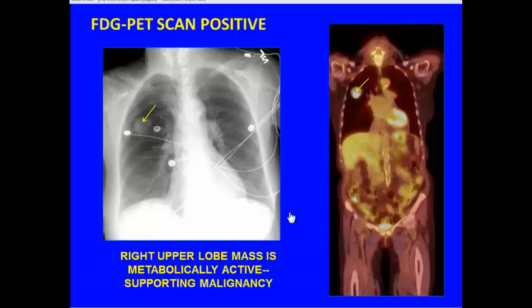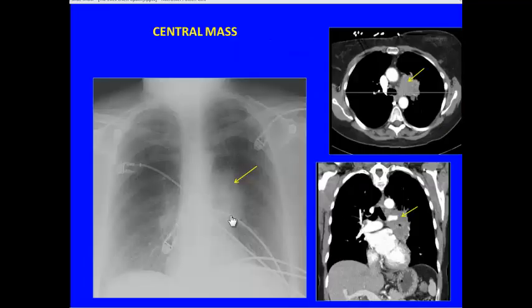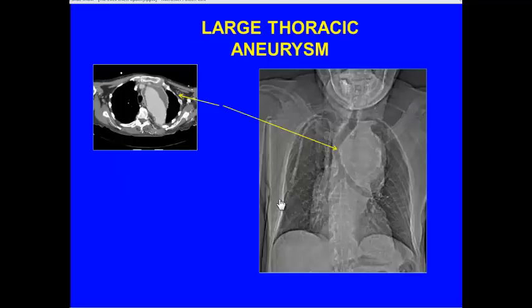So what else would we look for? Well, with our imaging now, with the FDG or the PET imaging showing radioactive glucose uptake, a lesion that's metabolically active, that's certainly much more worrisome to be a malignancy. Those may be ways we might characterize it. Other ways we'll characterize masses are just by the locations. I mean, we know from just what we've seen before, that's that upper mediastinum, and we're going to have to think about thyroid lesions there. Lesions in the hilum, we could worry about adenopathy or some sort of mass there, so the location can help us out a little bit.